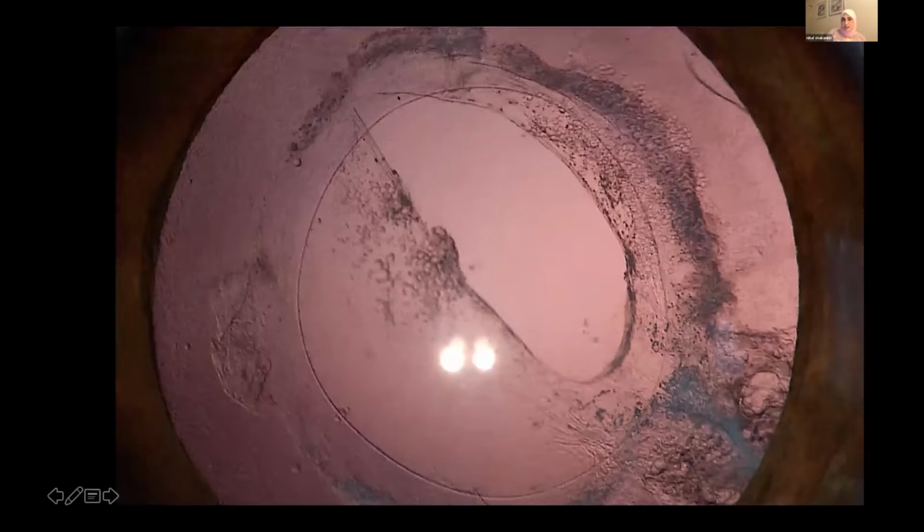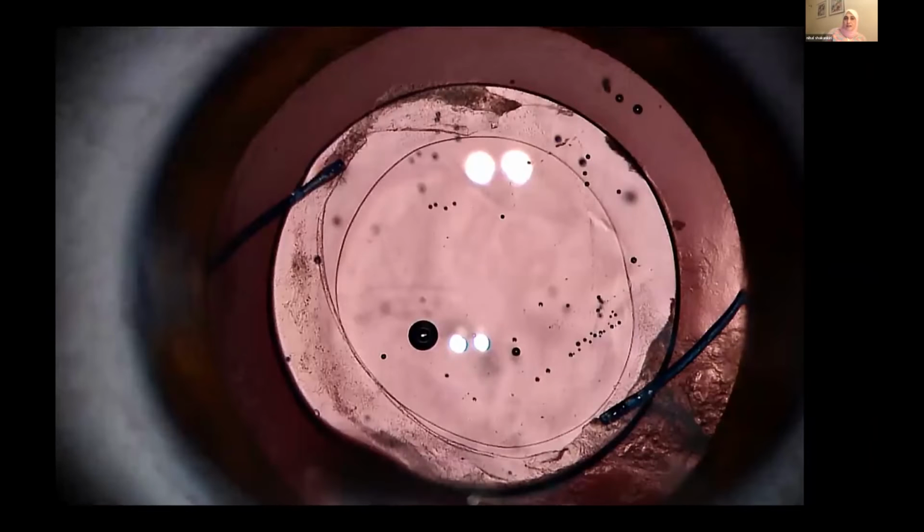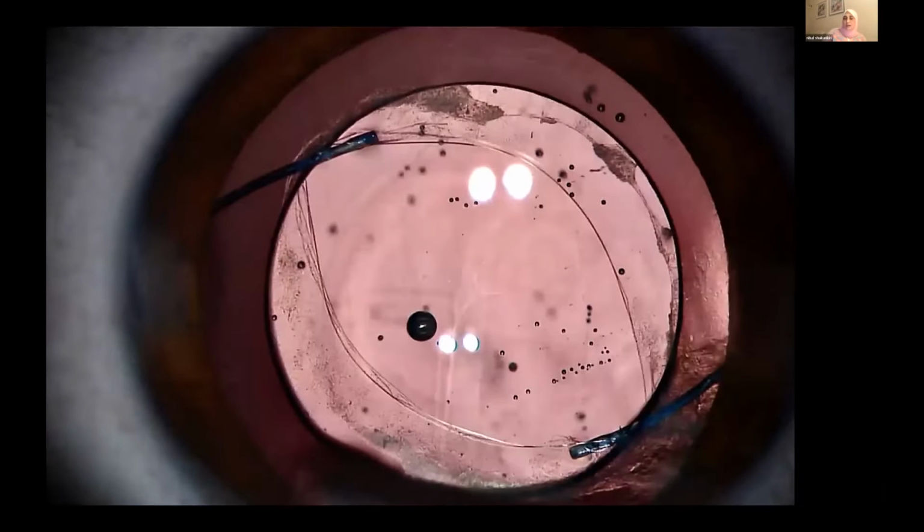You can see here the edge is sharp and it goes beyond the edge of the anterior capsular rexis. So in these cases, we remove totally the posterior capsule, implant the IOL in sulcus, and then we can safely perform optic capture technique in the anterior rexis. And this is a case of optic capture technique. It is beautiful, as if implanting inside the capsular bag.